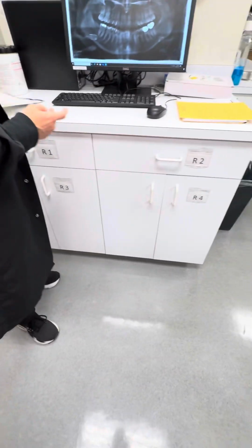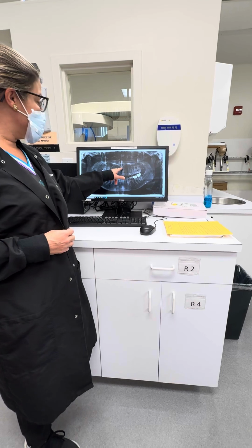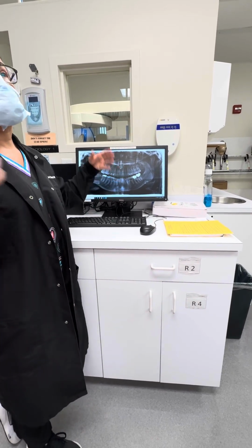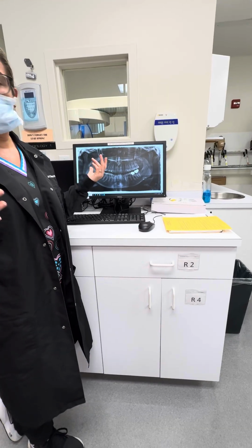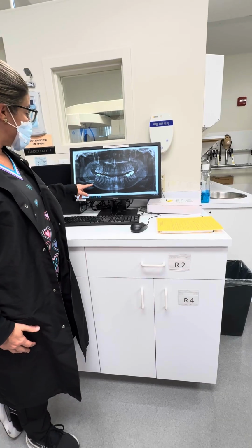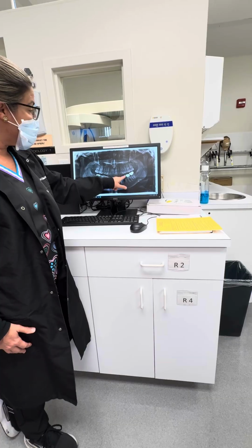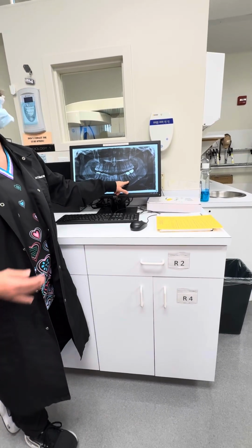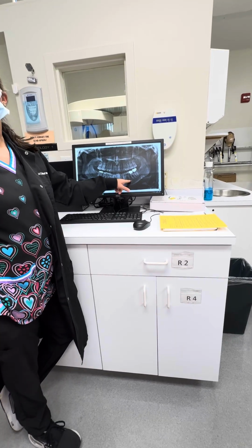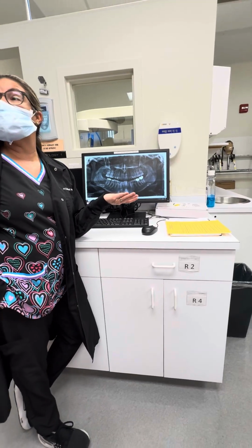So then the last thing I'll show you, so this is my Pano. I wanted to show you guys my mesiodens, and then I wanted to talk a little bit about anatomy. So again, that's something that would be abnormal, out of the ordinary, not normal anatomy, right? You notice the mandibular canal here, and of course the border of the mandible. Look at the mental foramen where it's located. That one is located directly below the apex of the root of the second premolar, tooth number 20 on the left side. So again, this is a good review to go over for when we do anesthesia.